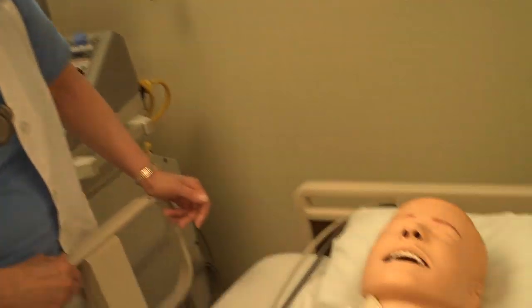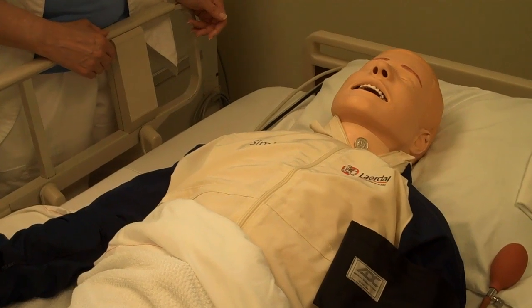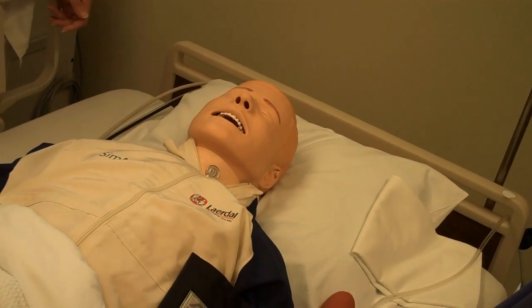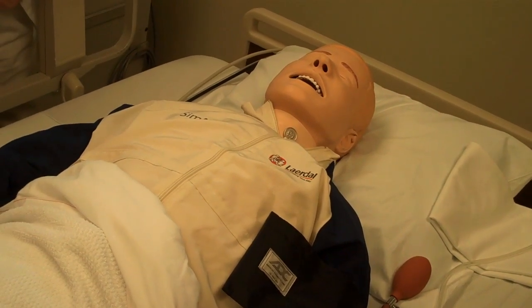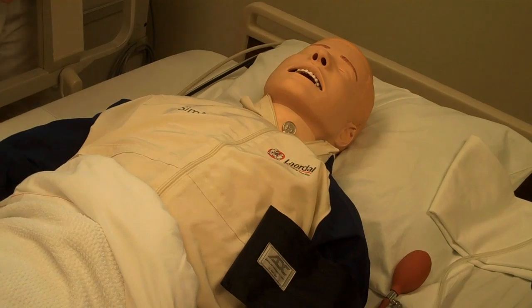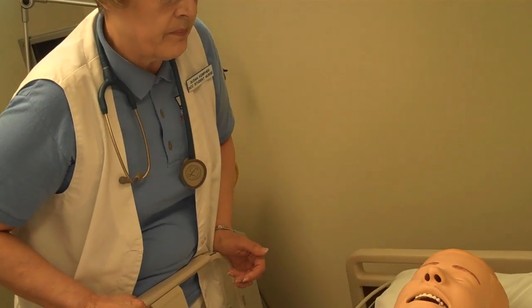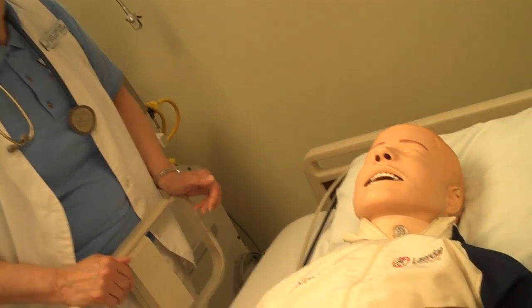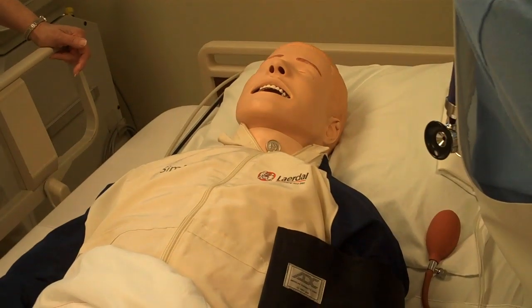'Is your pain sharp?' 'Give me something for this pain. It hurts. It really hurts.' 'We're going to get you some morphine here. We're going to put it through your IV so you should be feeling better here pretty quick.' 'I'm quite nauseous.' 'Because of the morphine, I'm going to attach a pulse ox so we can monitor your oxygen saturation.' Morphine's going in right now. 'How's your pain level now, Mr. Brown?' 'Is it a seven?' 'Yes.' 'Still seven. I just gave you some pain medication. Are you still feeling nauseous?'